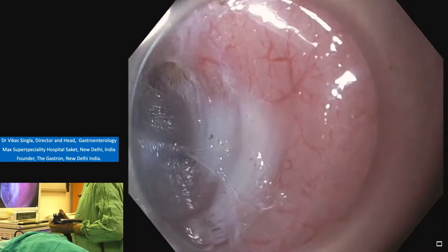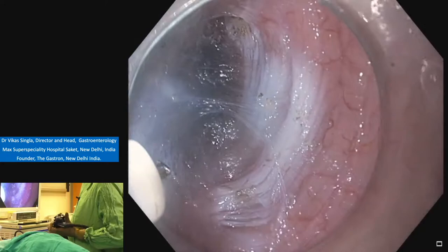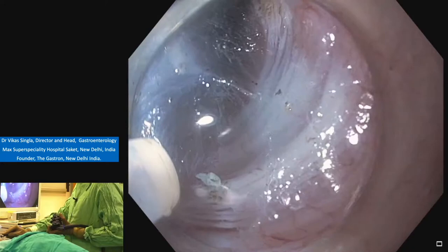Now we are at 38 cm, it means we are very close to the G junction. Right side again palisading vessel, it means esophageal side, still esophageal side. Now the trick here is to inject more fluid. Please inject more fluid, otherwise there is risk of mucosal injury. And stay on the right side. Dissect the fibers.